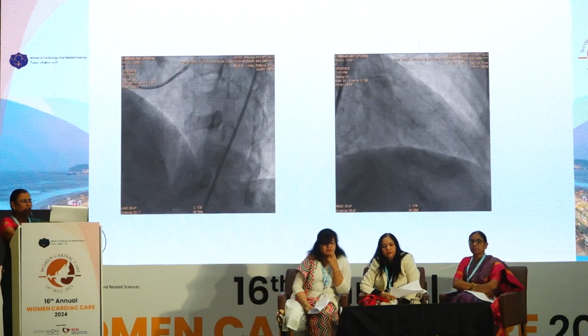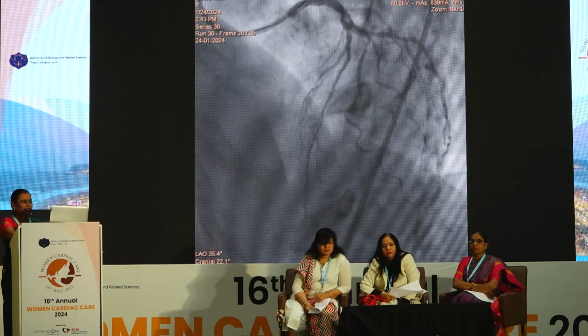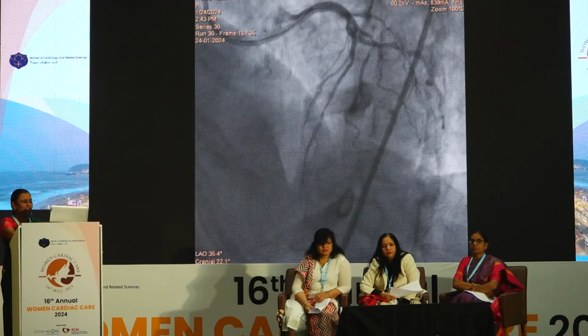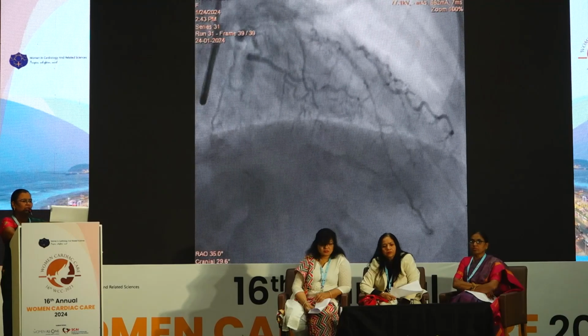Even though the collaterals are filling the distal segment, we have not preferred a retrograde route. It is a simple antegrade route with only wire escalation. We succeeded, but unfortunately the distal vessel is small, so we could not place a stent, and this patient is doing well. This is the final result.